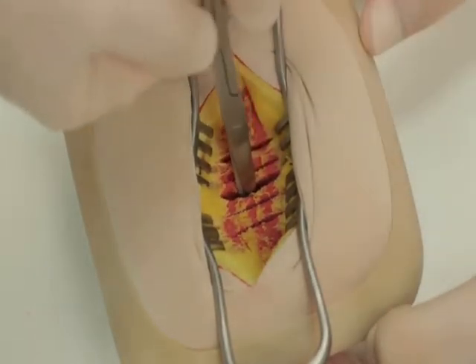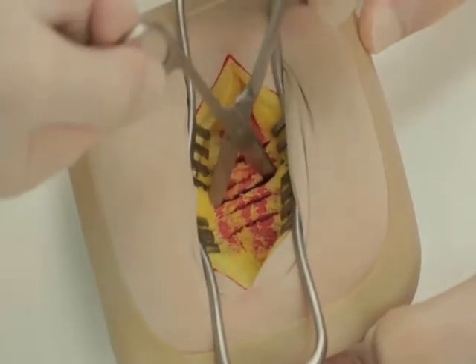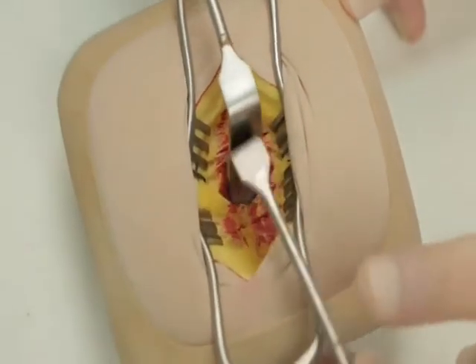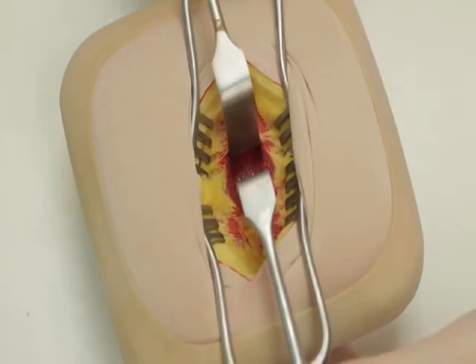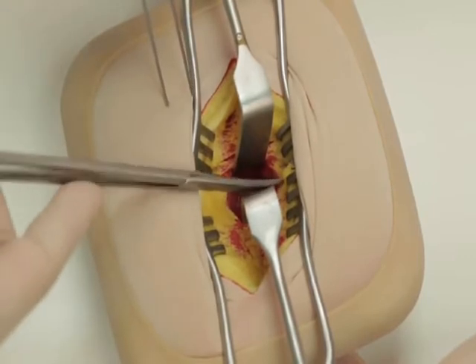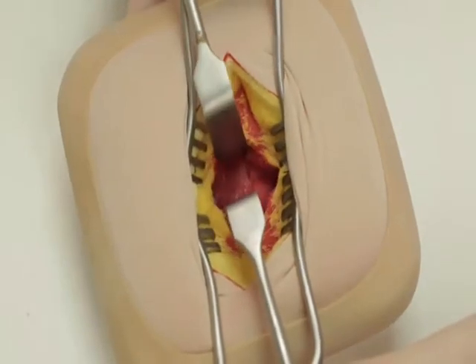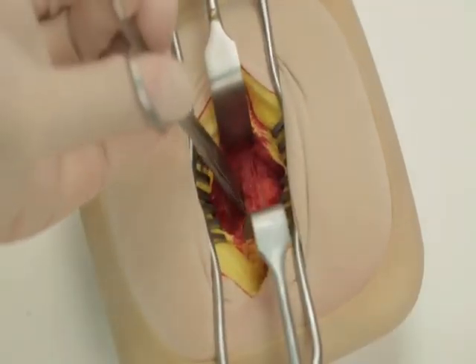We have purposefully scored this model to demonstrate the technique, although in the models with which you are presented this will not be evident. The split can be widened using Langenbeck retractors to display the muscle underneath. Transversus abdominis should also be split in the line of its fibres.